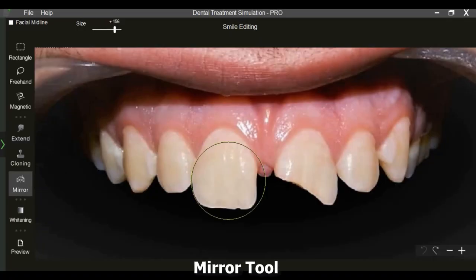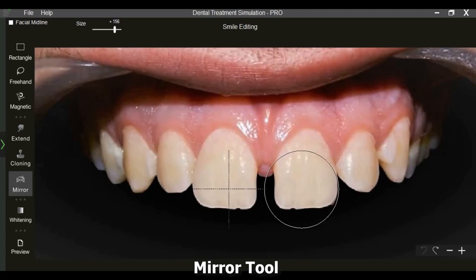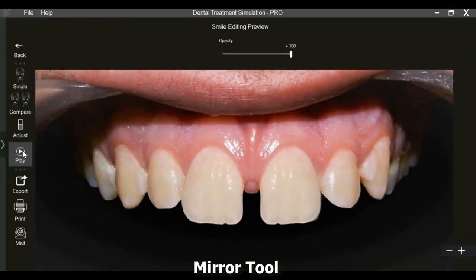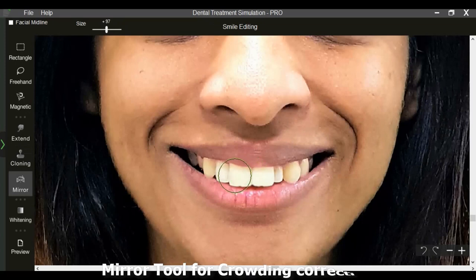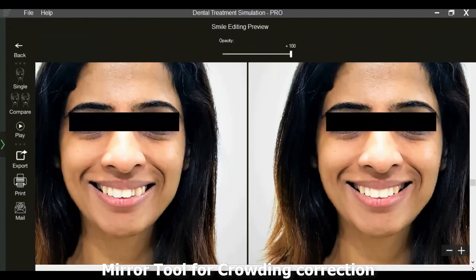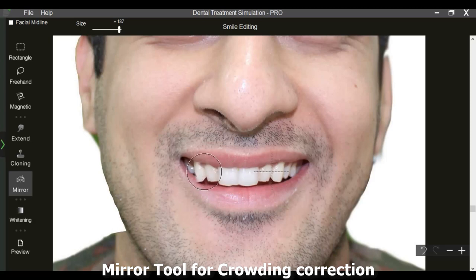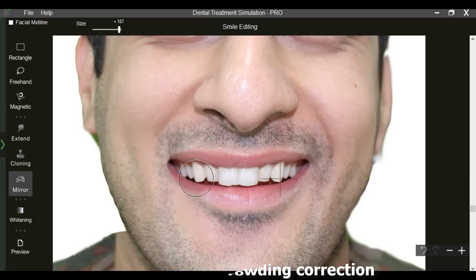The mirror tool can copy an area, mirror it, and paste wherever needed, all in a single click. We can simulate crowding correction using the mirror tool. The area to be mirrored is first selected by pressing the Alt key and left click, and then paste it as required.